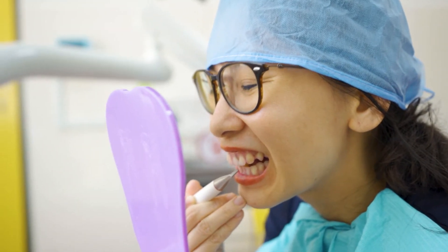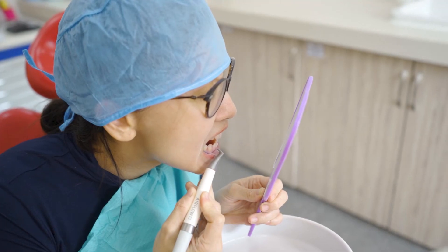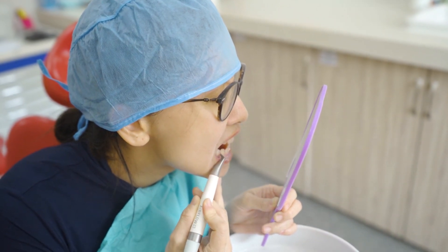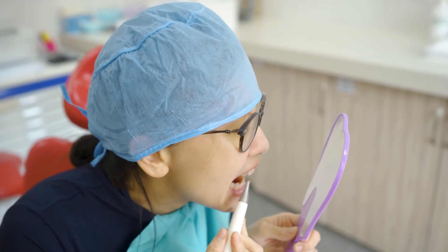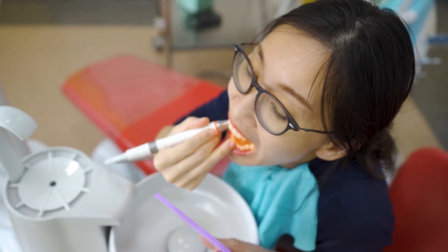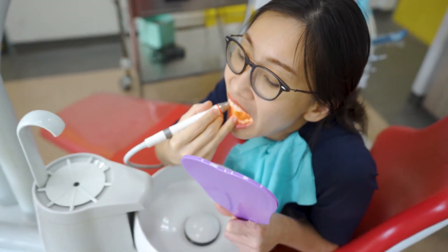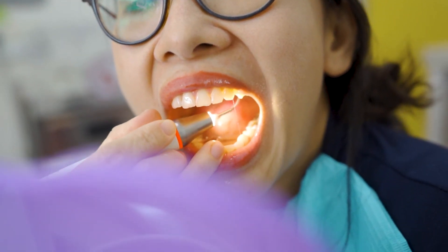Once we can feel that done, you won't feel good. So, is it clean enough? Can you see any stain around my teeth surfaces?